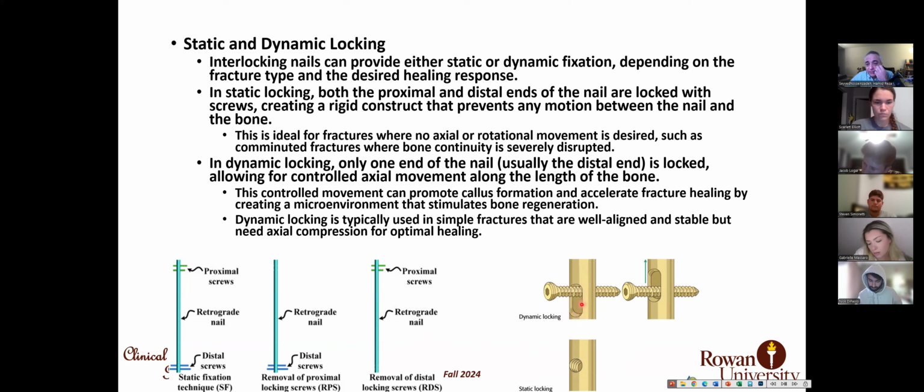It is larger, and when you put the screw away from the fracture site, the fracture site is here, okay? The screw is away from the fracture site. When you apply load, the nail moves upward, but it is not too much, just as much as the length of this hole allows.